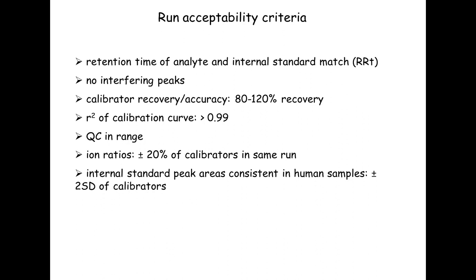And these are all things that you can use your validation data to determine, right? So you see how your assay performs during validation, and you can use that to set criteria for when you go live, because you want to be able to catch issues, but you also don't want to fail every single run that you have. So it's really important to do a really good validation, very in-depth and over a significant period of time, so that you know how your assay performs on its best day and on its worst day.